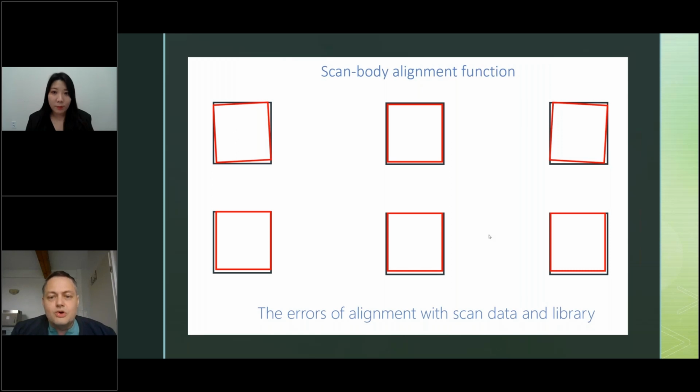You can though record occlusion with the healing abutments, as I showed in the webinar. This is a better way, with high healing abutments that are almost touching the occlusion, that you can do.